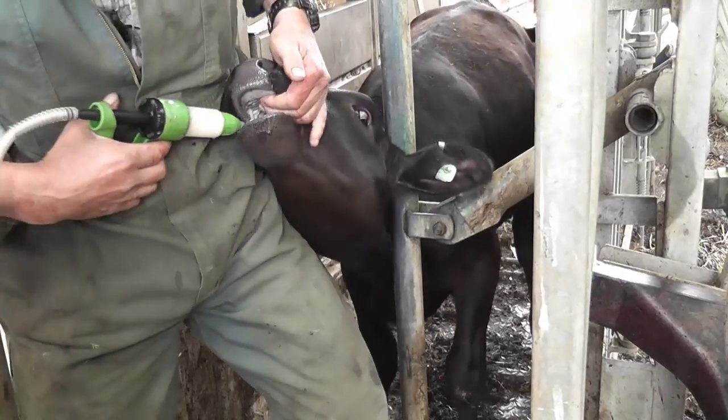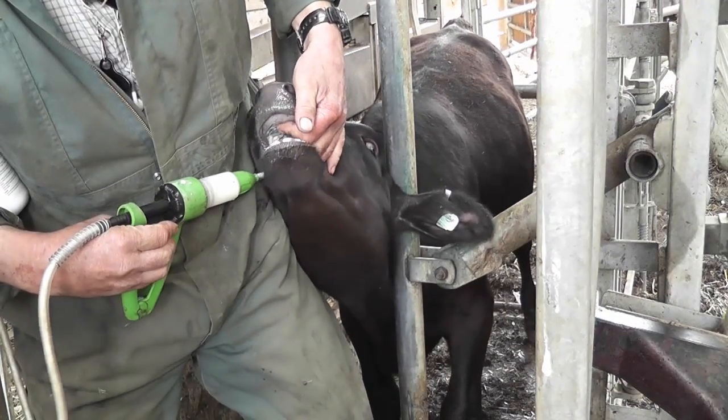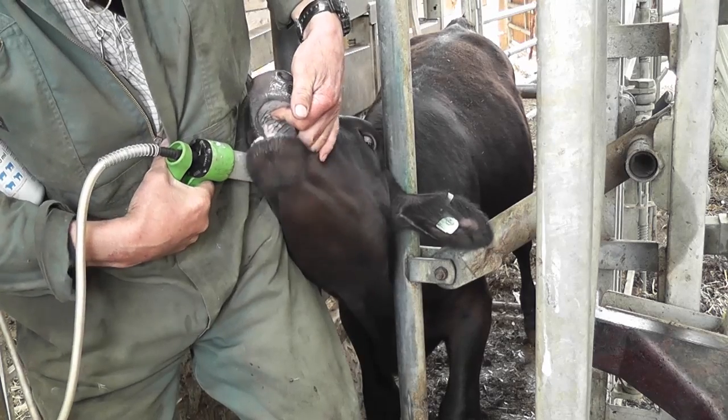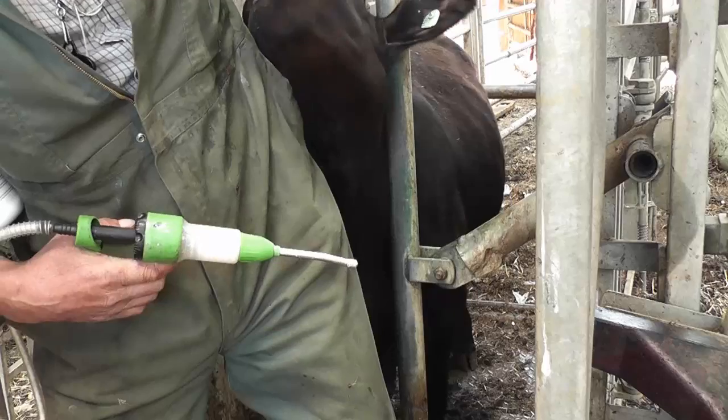The head is lifted and the medication is injected to the back of the tongue, the back of the mouth, making sure the animal's not jumping around too much, and that it swallows everything. The head is held there until all of the medication is swallowed.